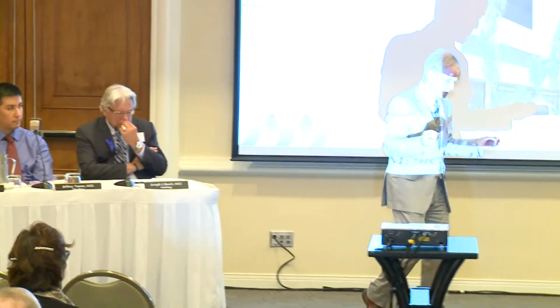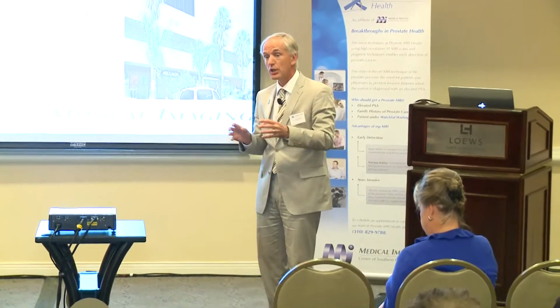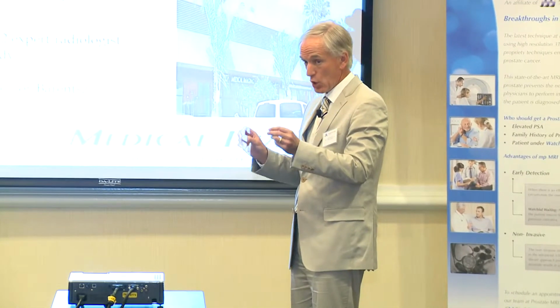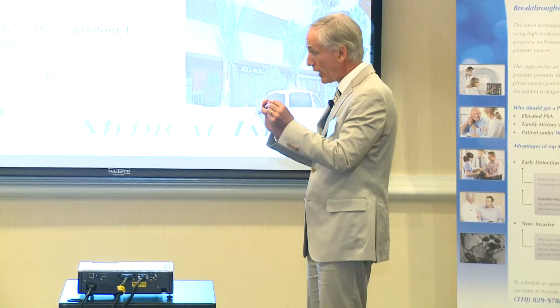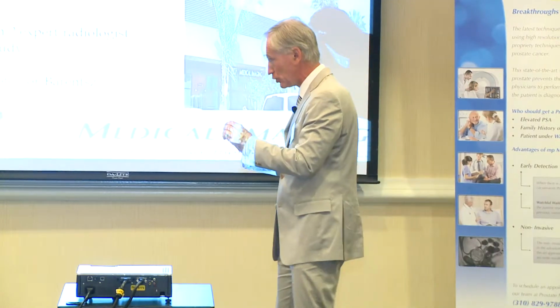Having said that, we have limitations, of course. So I think what needs to be done is we need to evaluate and find out which patients can be done on the MR fusion biopsy, probably the larger tumors. If you see a larger tumor anteriorly, you probably will recognize it on ultrasound and you will hit it. But all the patients with PI-RADS 4 and 5, read by good radiologists, who have a negative biopsy, no tumor, they should be back with MR-guided biopsy. So you should also have teams to do MR-guided biopsy.